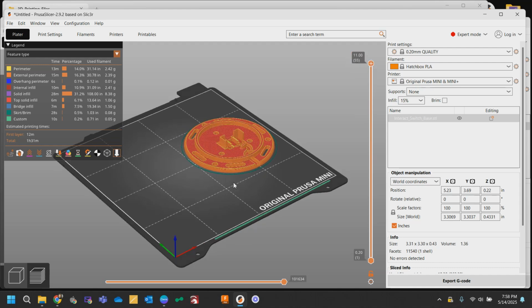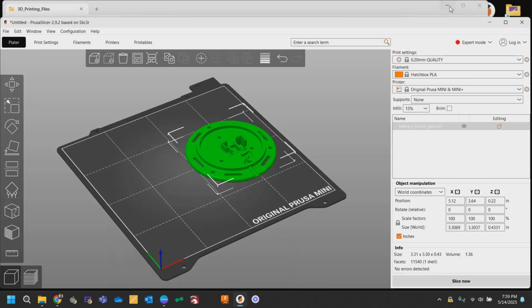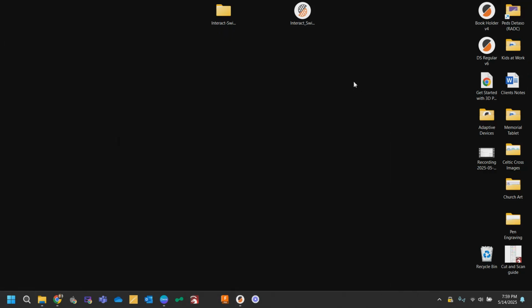Once you've sliced it, then we need to export all this information as a new file, and this file is going to be called a G-code. So you click this export G-code and it'll spit it out onto your desktop right here. That's your G-code file that tells your 3D printer how to print that model that you downloaded off the internet. I'll put this into a flash drive or an SD card and then take that to my printer and push print.